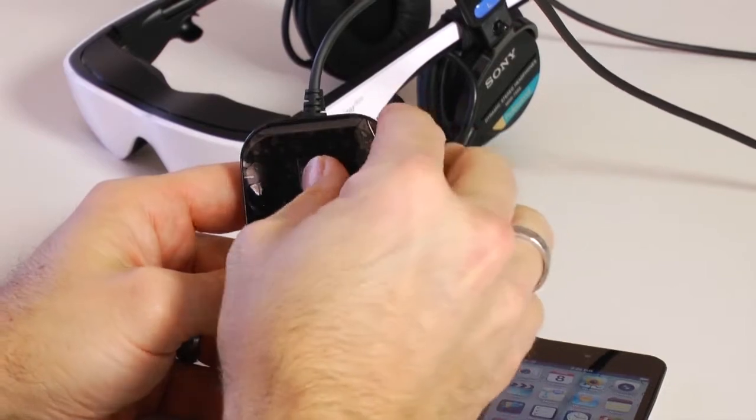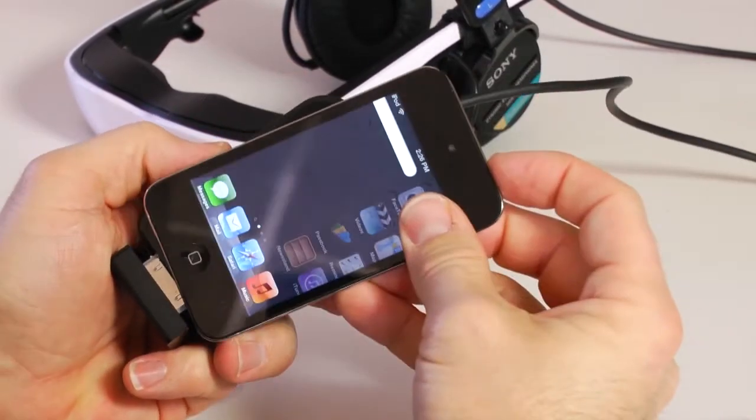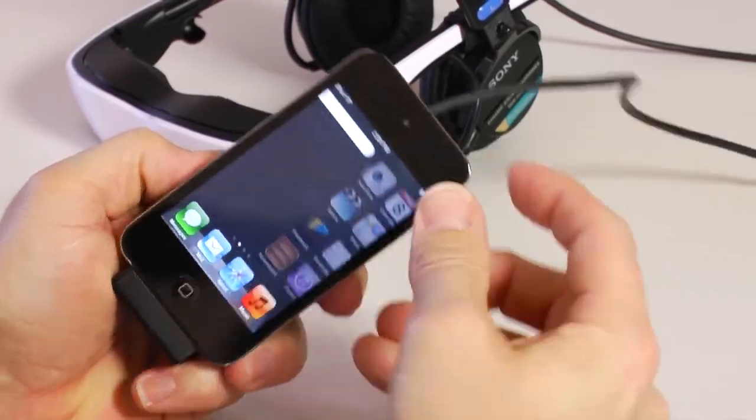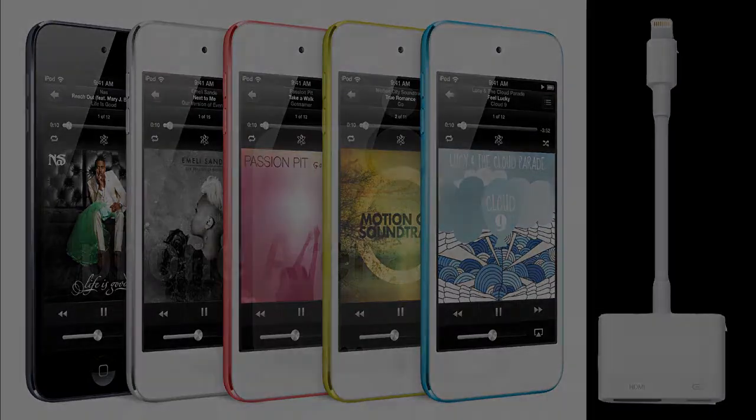The Cinemizer Apple kit is for 4th generation or older Apple devices. New 5th generation Apple devices require a different adapter called a Lightning to HDMI adapter, which can only be purchased from an authorized Apple reseller. Once you have this adapter, the Cinemizer can be connected using the HDMI adapter, which we will discuss in the next section.